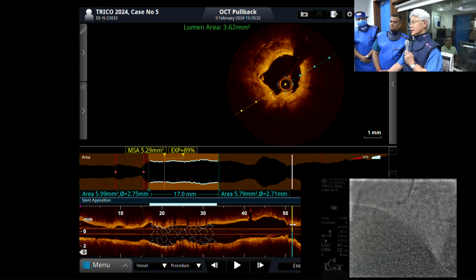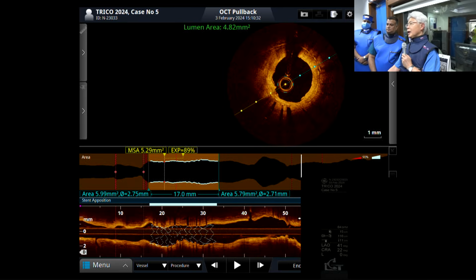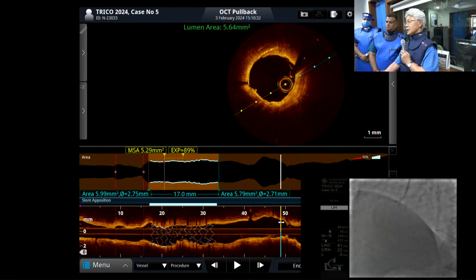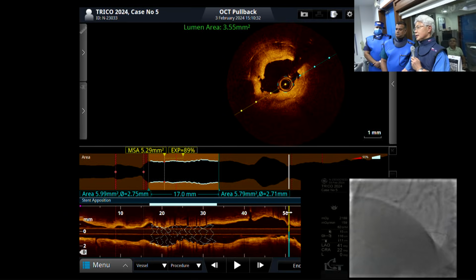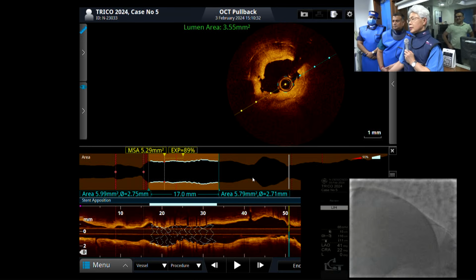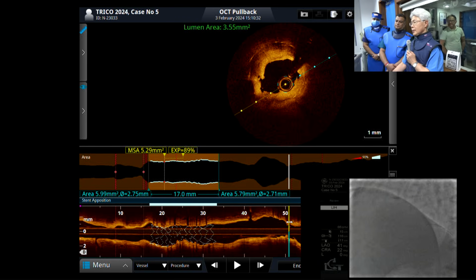Is an OPN an option? No, I don't think so. Should we remove the stent? A larger size cutting balloon, 3.5. A larger size cutting balloon should be okay, but this calcium site is difficult to dilate. I don't think anything is going to expand that, because there's a stent on the outside and the calcium is trapped inside the stent. We are not going to break the calcium small enough to come out of the stent.